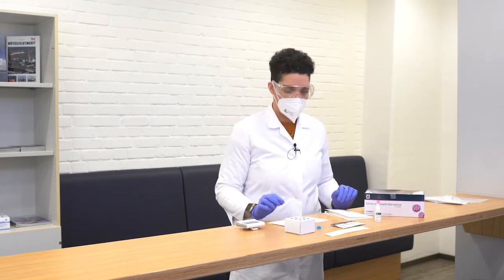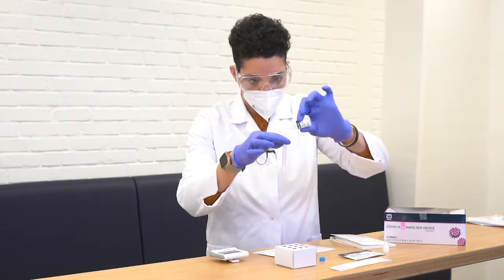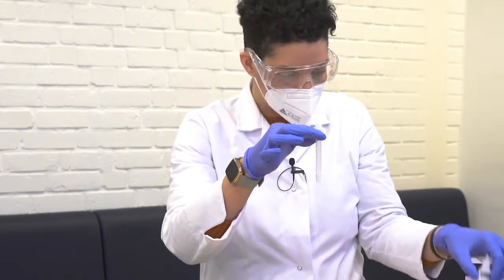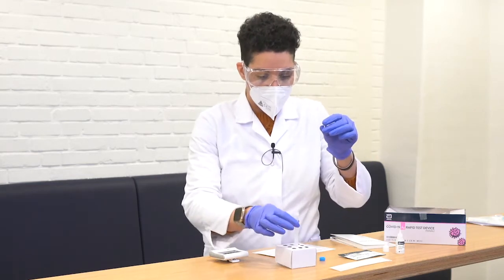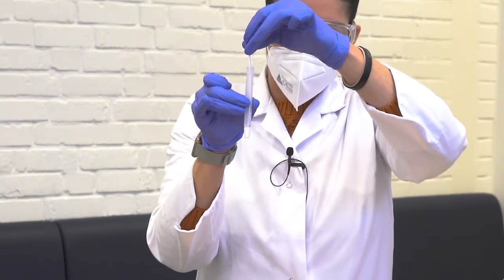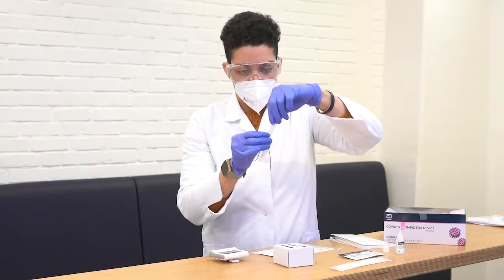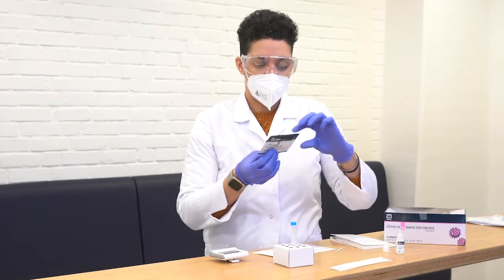So once you have the swab, you're going to have to take the liquid and pour it inside the tube. There's a little marker on the bottom that shows you how far you're going to have to go. And put it back so it won't slip. Take the swab that we just took out of our nostril, enter it into the tube, and squish the tube slightly before entering it all the way. Put it all the way down, and then there's a little part where you can crack the swab. Then close the tube and open up the test itself.